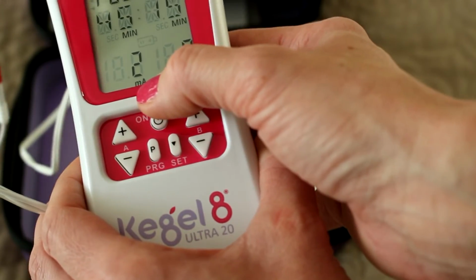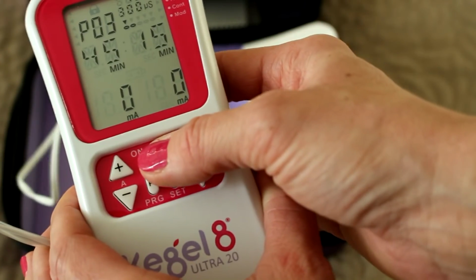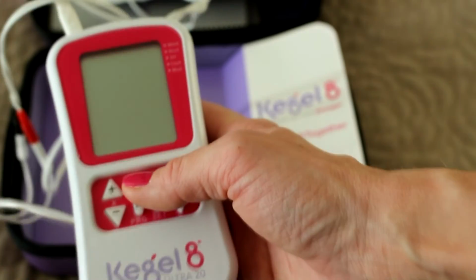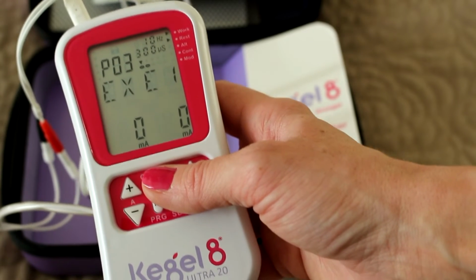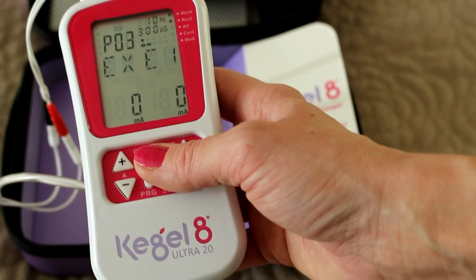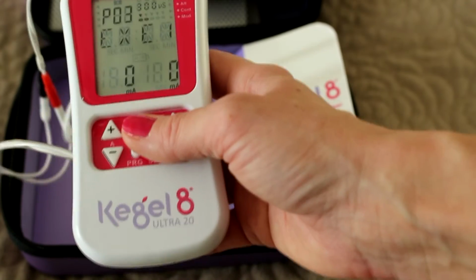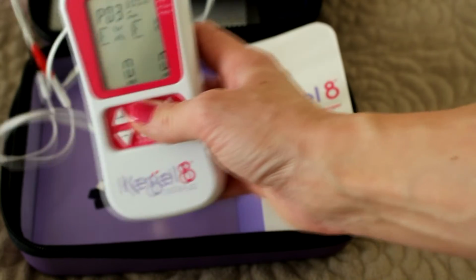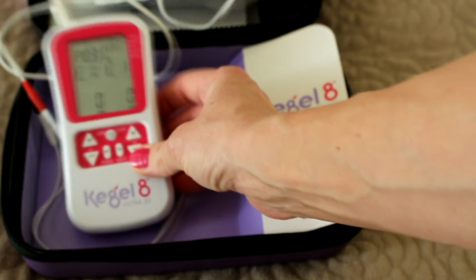Now, the milliamperes, this is not going to work because I haven't got it inside me. Anyway, I was recommended to do it basically between 30 and 50 initially. I could only manage initially 21, I think, and now I'm on about 45, which I believe is great, because when your muscles strengthen, you can bear more.